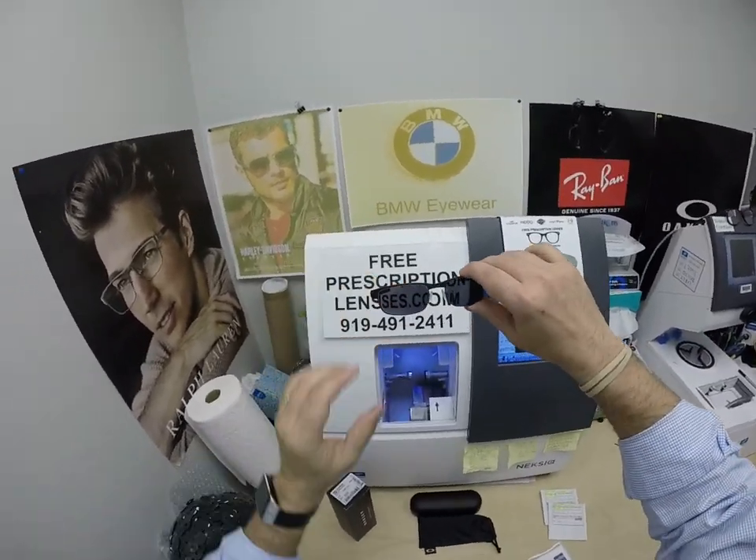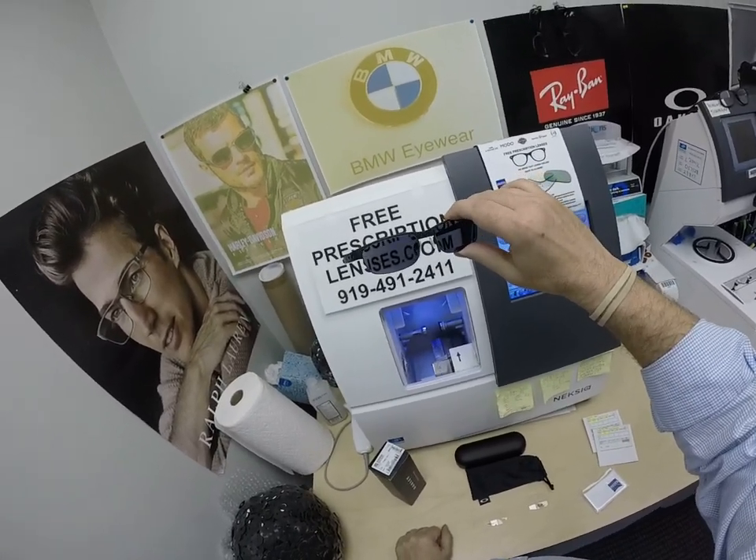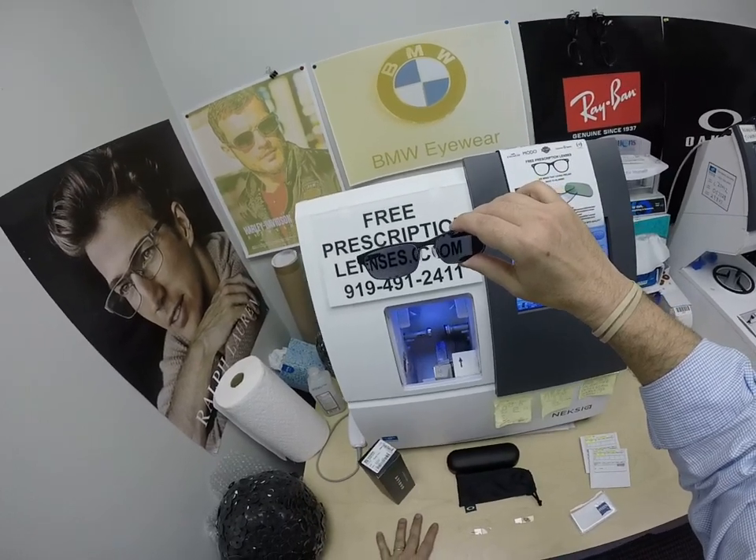He got the Zeiss Photofusion Extra Gray, which adds $129. The extra dark color is available in gray only. There's still the Zeiss Photofusion in gray, brown, green, and blue.